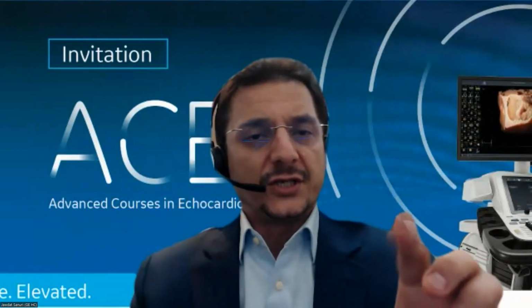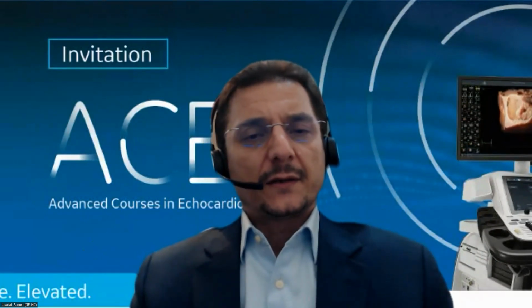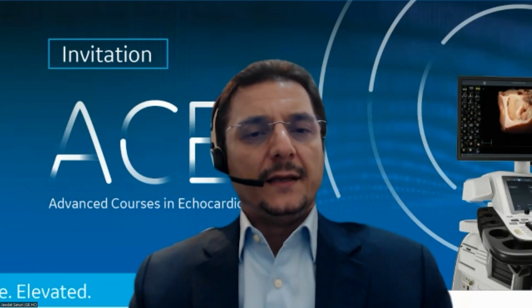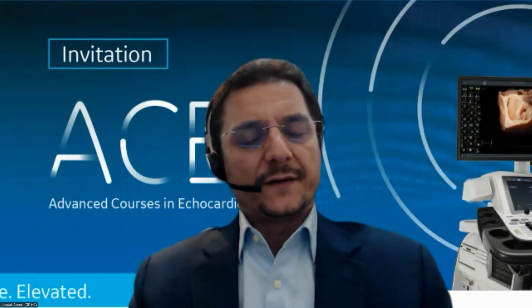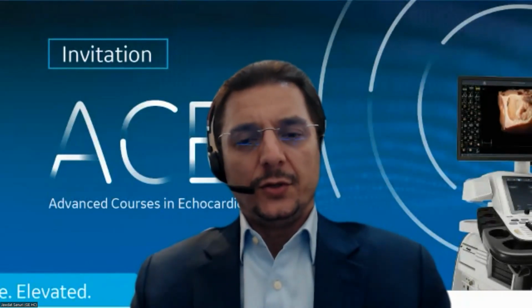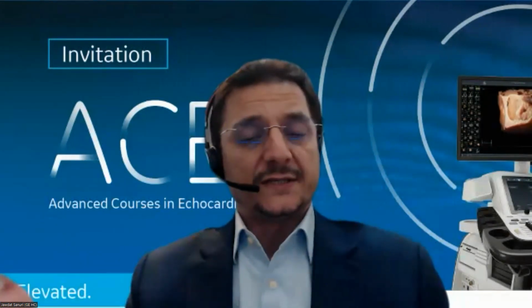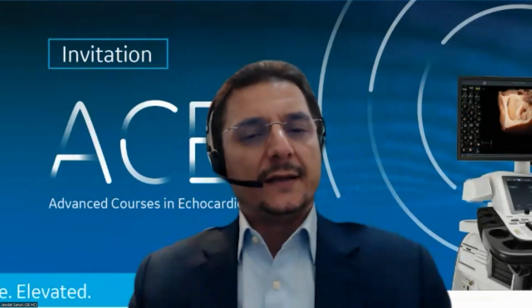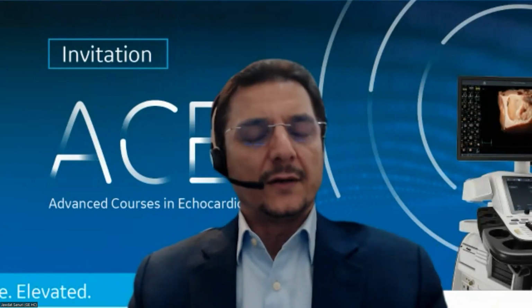You can apply PW and change the sample volume to match the diameter of the coronary artery, and get the Doppler waveform of it, whether systole, diastole, or, as you mentioned, with the reserve, measuring the Doppler before stress and during different stages. So yes, thank you for mentioning that, and you can apply it in the routine, within the study. You can freeze the study so that any acquisition will not intervene with the flow of the stress protocol. It will not be considered as another 4-chamber or 2-chamber view, because you're trying to acquire the specific views for the different stages. You can pause it, acquire and store, and then resume the stress protocol.